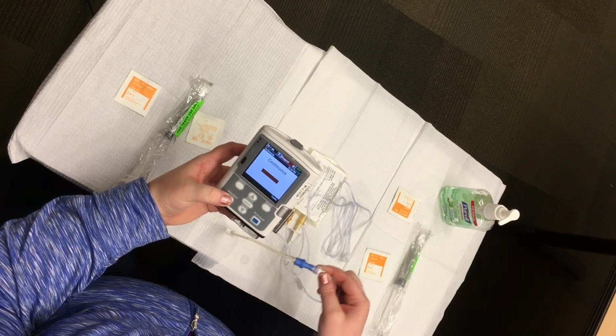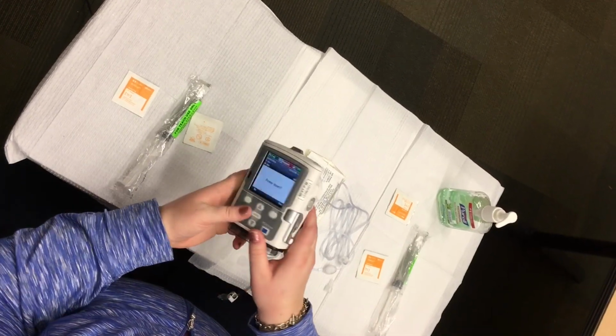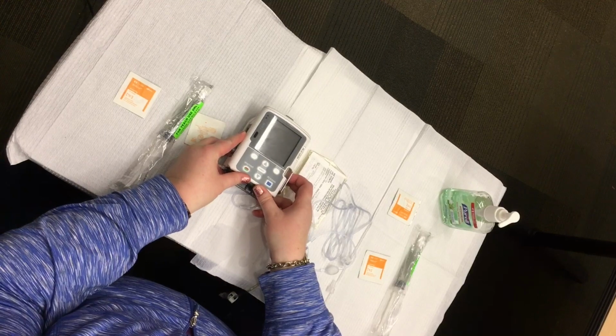Press the power button on the right side of the pump. The pump will ask you if you want to power down. Press the white button under yes. And that completes the process.